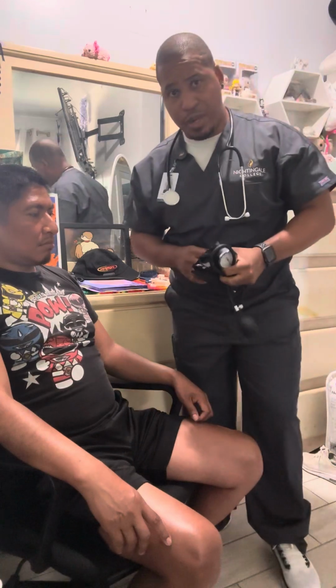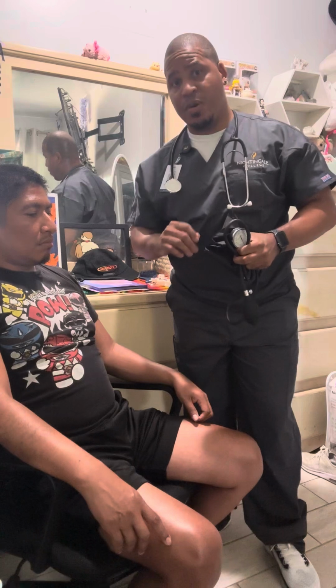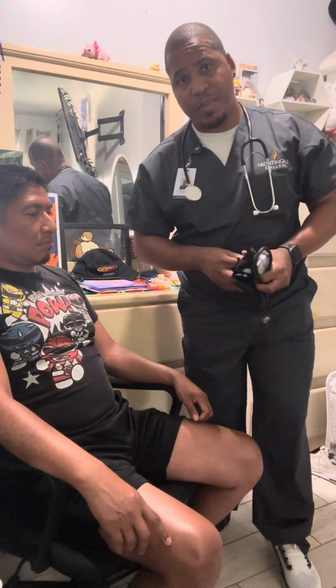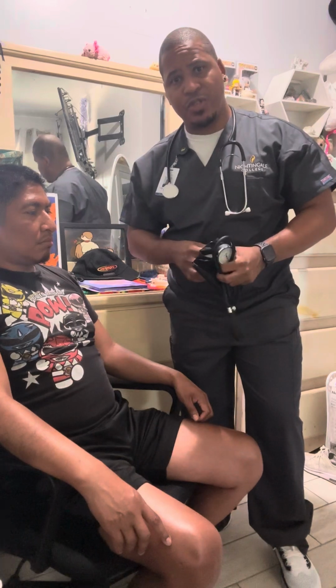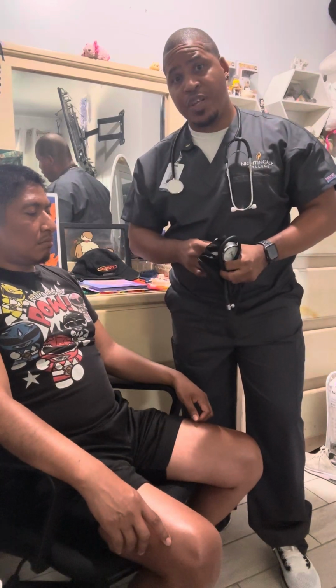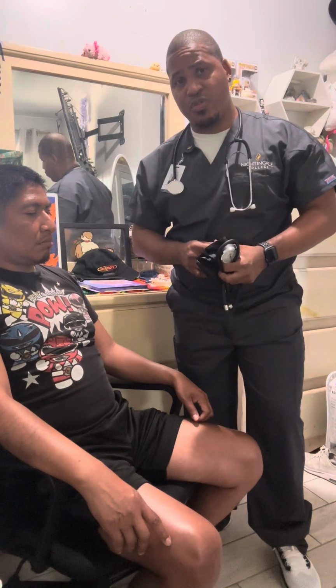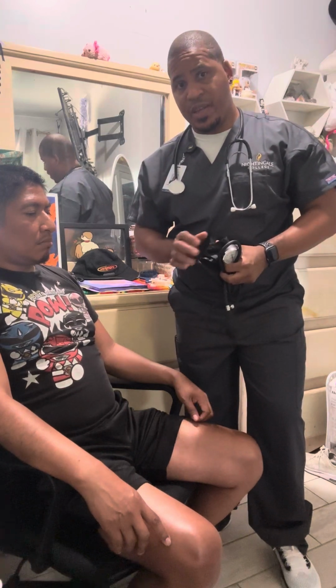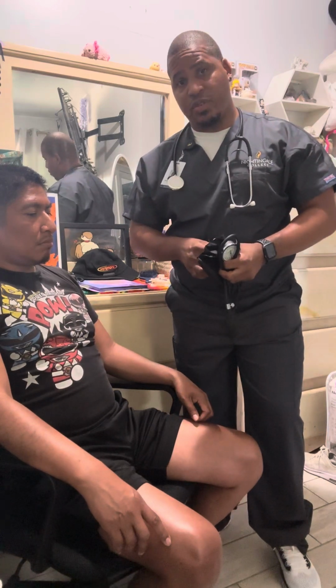For doing the blood pressure, I want to locate his brachial pulse. But first, let me give you a few ranges on blood pressure. 120 over 80 would be considered normal range. Anything that's lower or higher is considered altered.